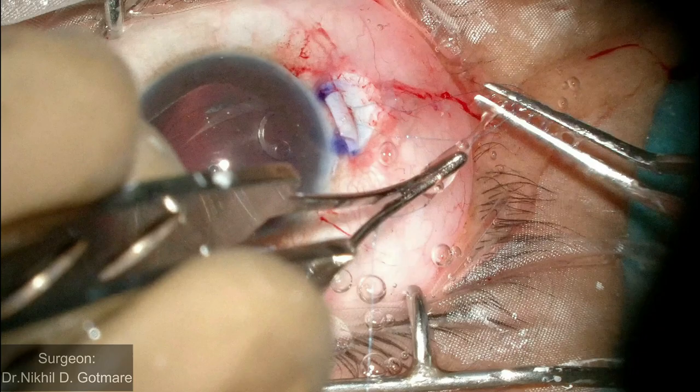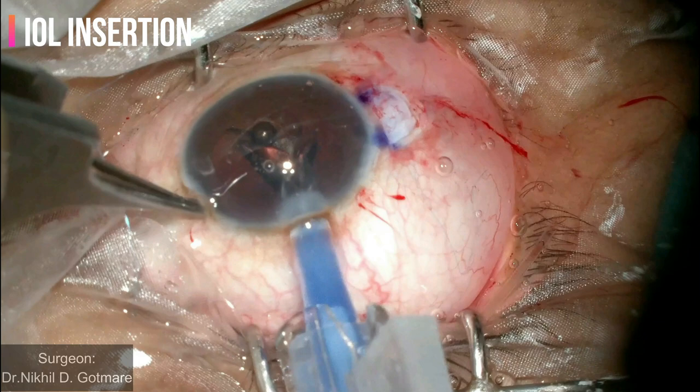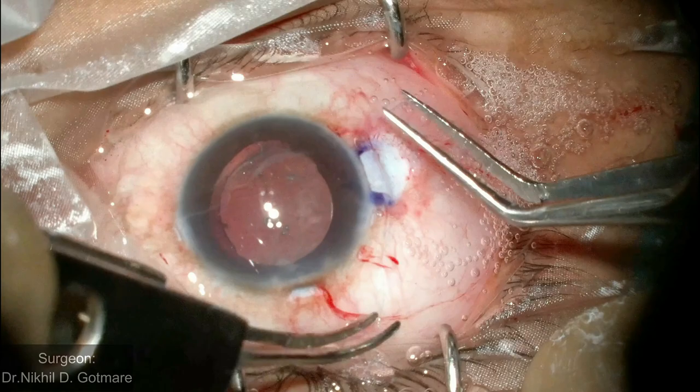A temporary stay knot is placed before injecting the intraocular lens. A foldable single-piece acrylic intraocular lens is injected through the main port and dialed using a dialer. Tension on the suture is then adjusted so that the IOL is centred, and sutures are tied with 3–4 knots, thus fixing the SIONI ring and the bag to the sclera.